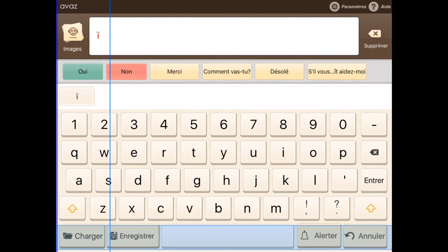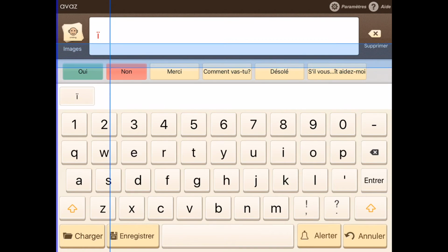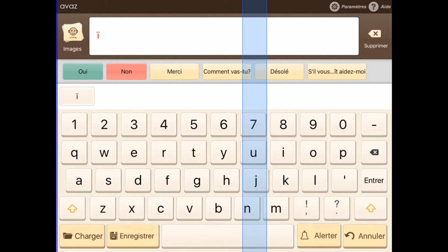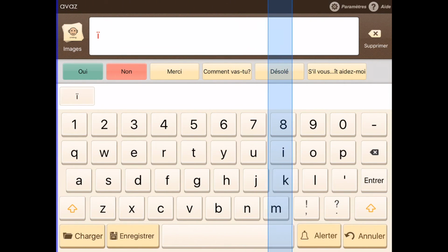As I pointed out in the settings earlier, you can adjust the speed of this, either faster or slower, to make it easier. But essentially what you would do is keep scrolling through the options with the right switch when you have the tap or hold, and this will eventually come up. And then as I showed you in the settings for accessibility and for switches, there's a whole ton of other menu options that you can add there.